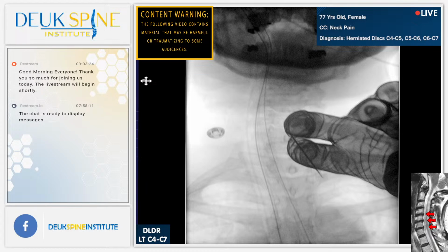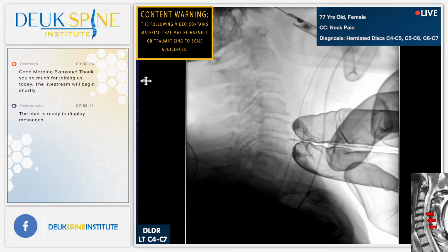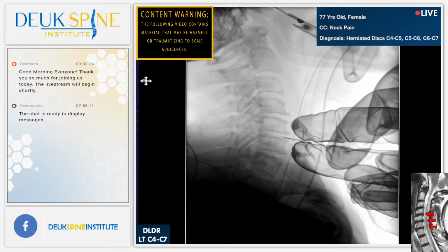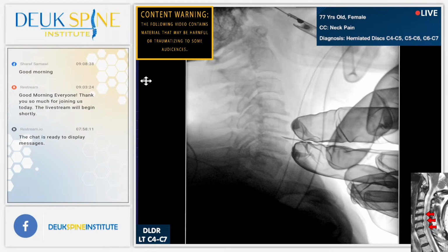Shot. All right. I'm entering the annulus through the front. People ask me, when you enter the annulus through the front, doesn't that damage the disc? The answer is no, it doesn't. Because there are tissues in your body that can be spread apart.